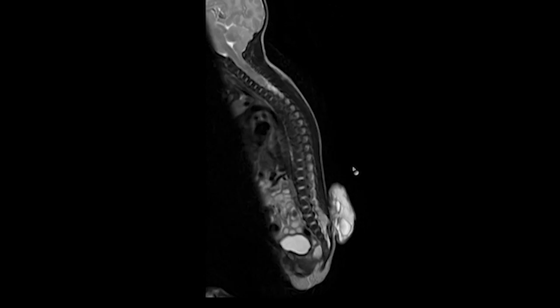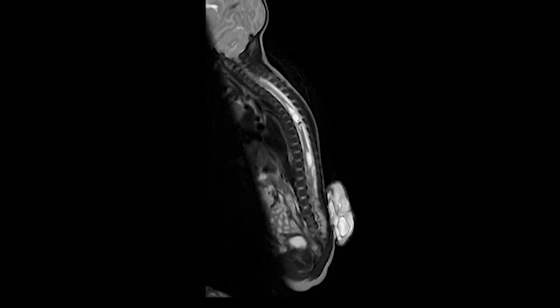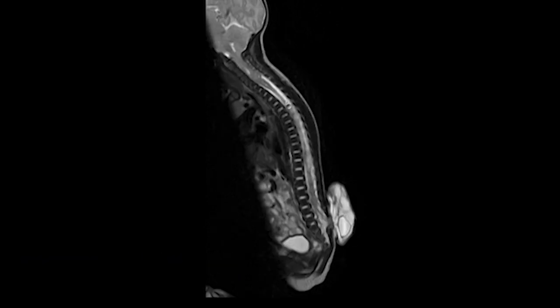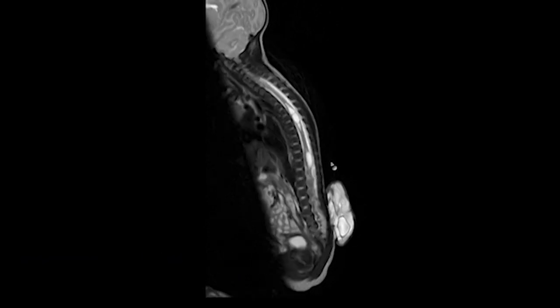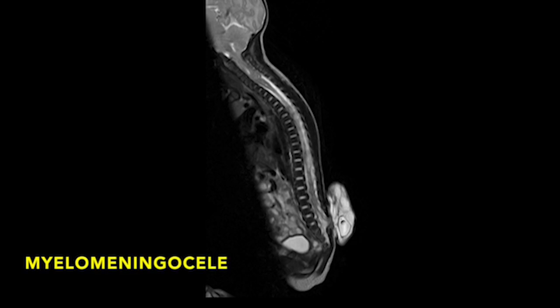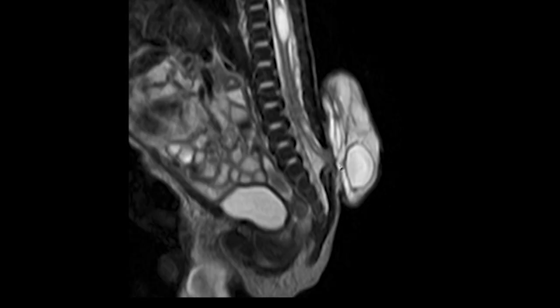This is another case. Sagittal fluid-sensitive MR whole spine imaging demonstrates hyperintense signal within the cord, suggestive of syringohydromelia, which is seen in the cervical and thoracic spinal cord. There is a defect noted in the lower lumbar region with herniation of the neural placode, meninges, nerve roots, and a CSF-filled sac-like structure — suggestive of myelomeningocele.